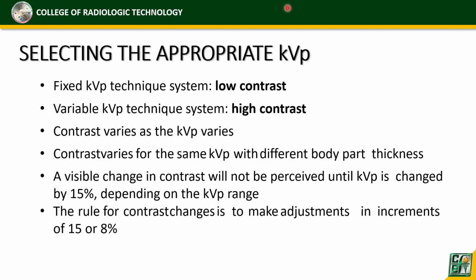Okay? So ano ba itsura ng film na na-develop kapag ang developer ay contaminated? Okay. So ang itsura ng film ay black na po? Ayun po, hindi na-develop. Yes, black. Ay wait, no. Hindi black, sorry. Kasi pag black na-develop siya, ano siya, clear. Clear na blue.